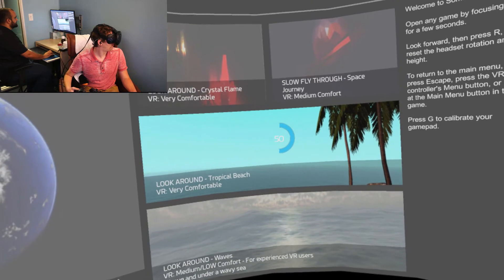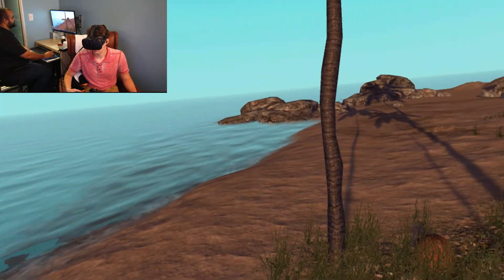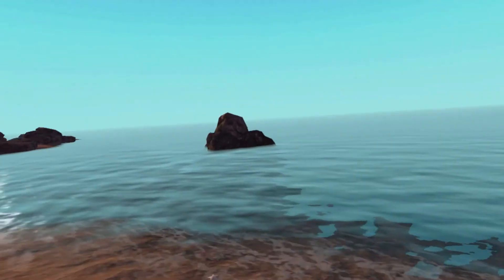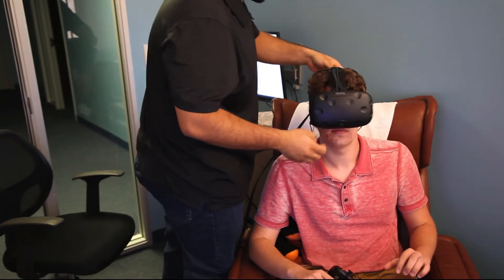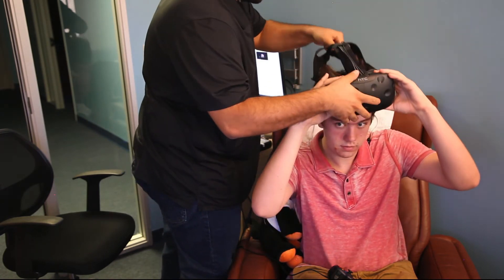You can look at the game and stare — it counts to 100 and then it chooses that game. So you can choose just by looking at the menu. And here he's in this beautiful environment. The feedback is part of this — you have this graying out. A lot of things get darker or smaller with the training frequency. With the inhibits, you get a graying out. So the feedback is involved and a lot of things are changing in the game. These are specially designed for this work, modified specifically for neurofeedback.